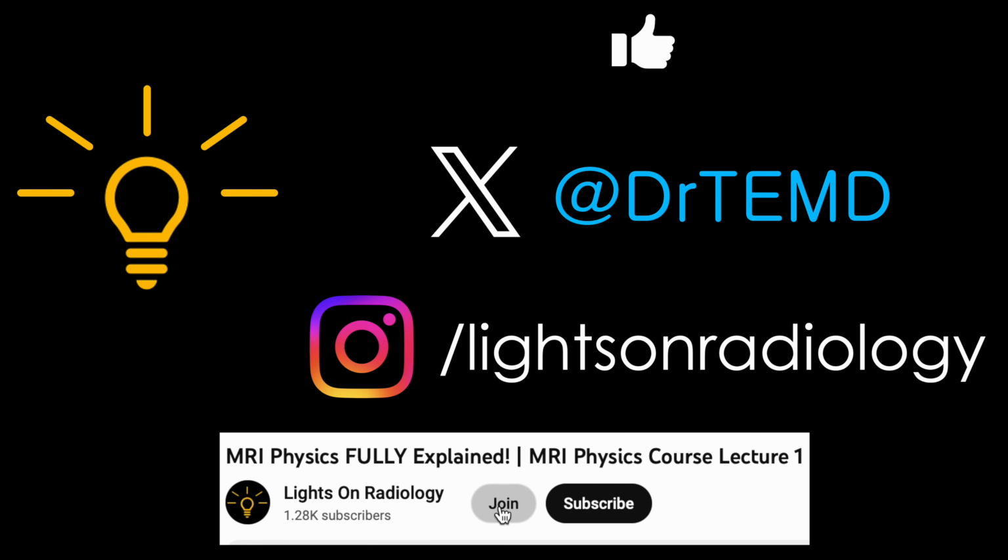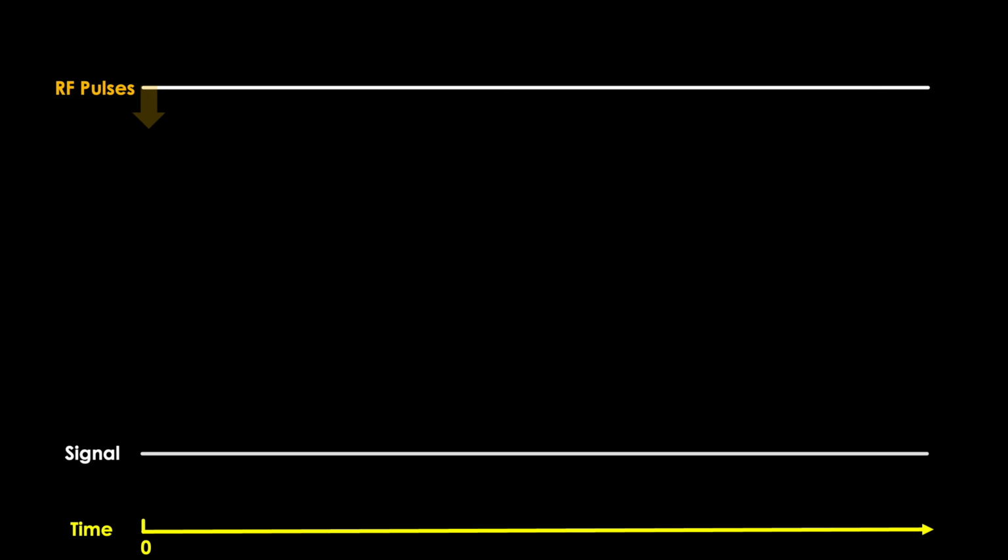With that, let's begin. Now, when discussing pulse sequence diagrams and echoes, the underlying concept centers on how signal evolves over time. If you followed the lectures up to this point, you know that we start this process of generating signal by means of an RF pulse applied here at time 0. This generates our initial signal within our receiver coils, which we call our FID, or free induction decay.